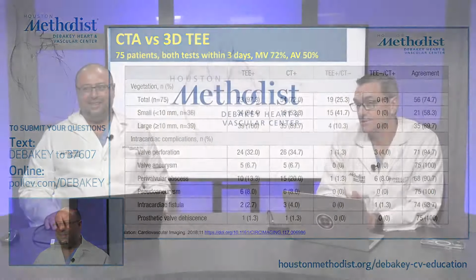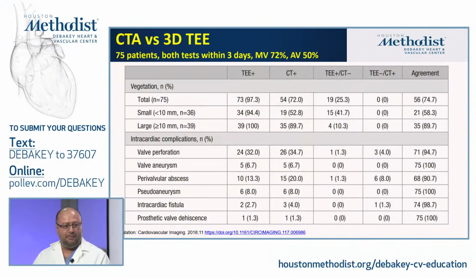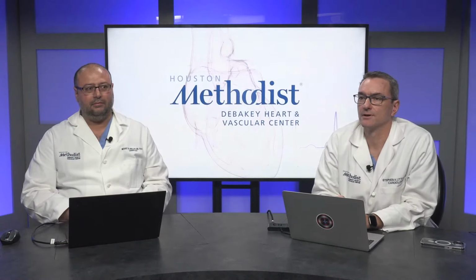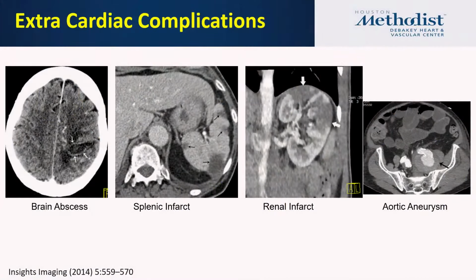I just wanted to, since you've got that slide up, comment on one of the other great things about CT in the decision around therapies. If you see a large lesion and you know it's endocarditis, the manifestation of a peripheral embolic event is often a push to go to surgery. We've had multiple cases where a significant splenic infarct or other, exactly as you've shown here, was enough to convince the surgeon that it's time to go to therapy. So not just the diagnosis, but also the next-step management often depends upon these extracardiac manifestations.